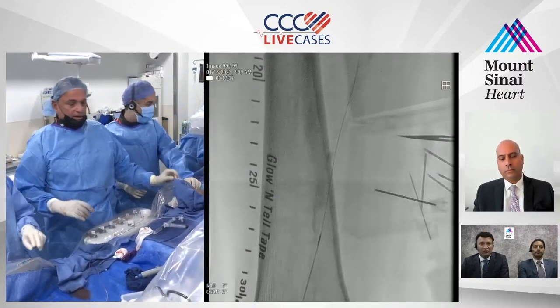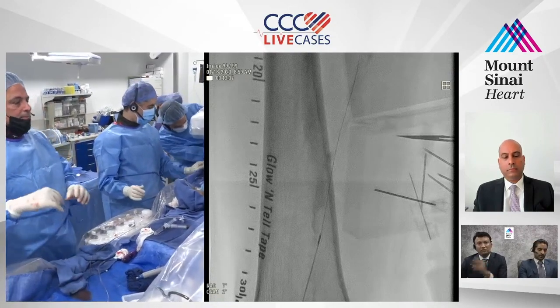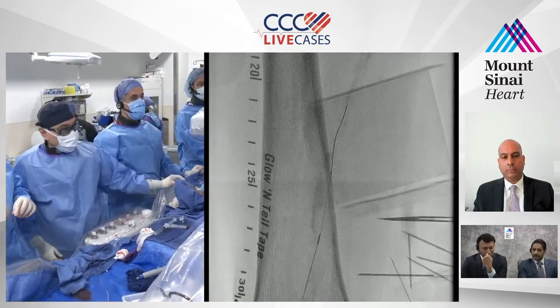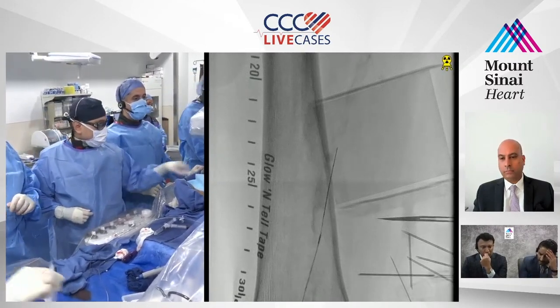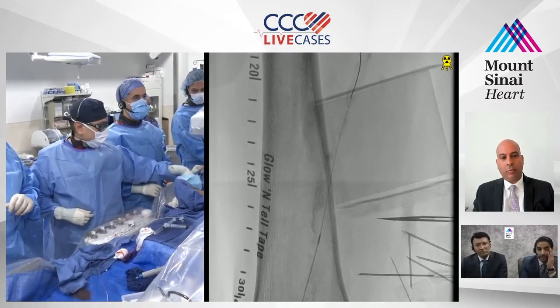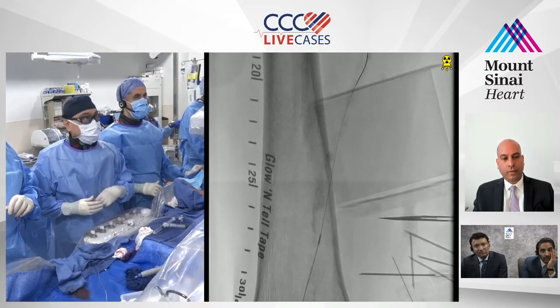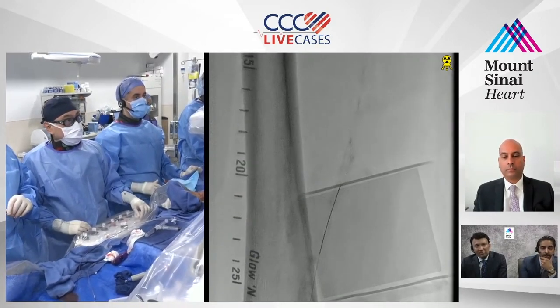Oh, thank you. You've got to bring the ultrasound machine to Dr. Rock. I'm on this side, right? Yep. Can we bring the ultrasound closer? Yeah, he's coming right now. Ray, what's the name of the other crossing catheter with the needle on the tip? Oh, Wingman. PK, do you want to give that a shot from below? See how that works, if you can.